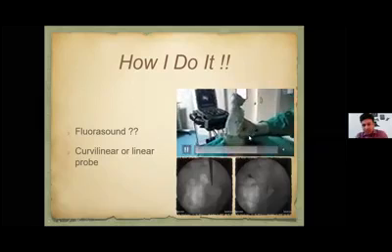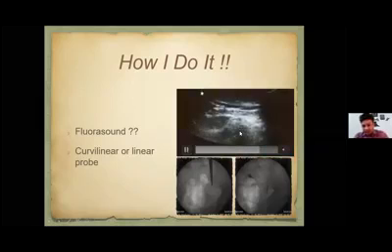This is how we go in plane, from medial to lateral; the needle position is medial to lateral. Here the needle is coming. It is not that good a video, but hopefully you are able to appreciate the needle. This is the lateral crest of the sacrum, this is the ilium, and this is the sacroiliac joint. Here we are entering from the medial to the lateral side.